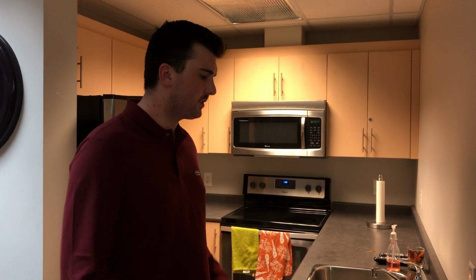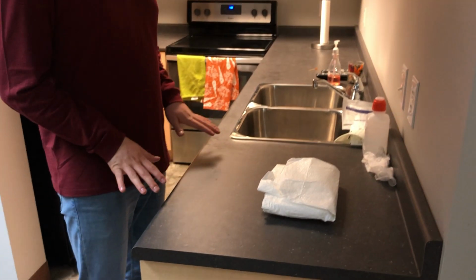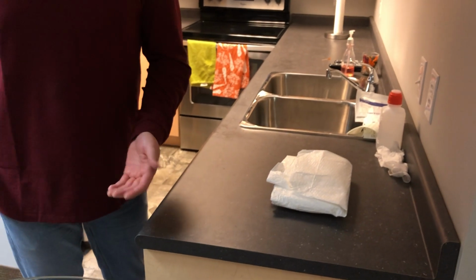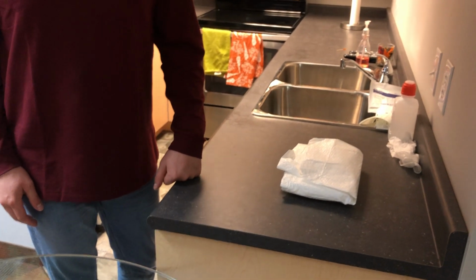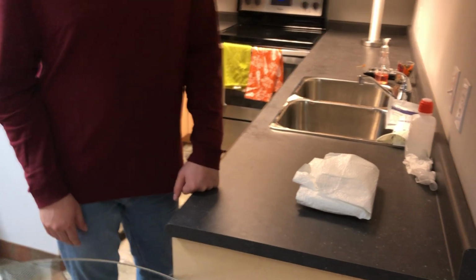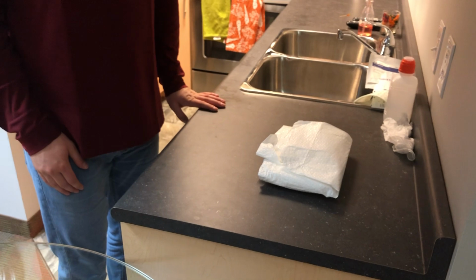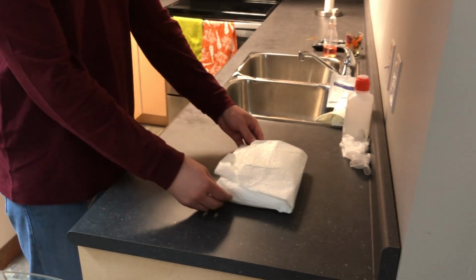Okay, so first I will perform hand hygiene. I will raise my side table to waist level to promote sterility. I've raised the patient's bed level, and I will raise his head of the bed to semi-Fowler's position so I can get a good plain view and good access to the dressing. Okay, so now that I have all my supplies, I am ready to go.